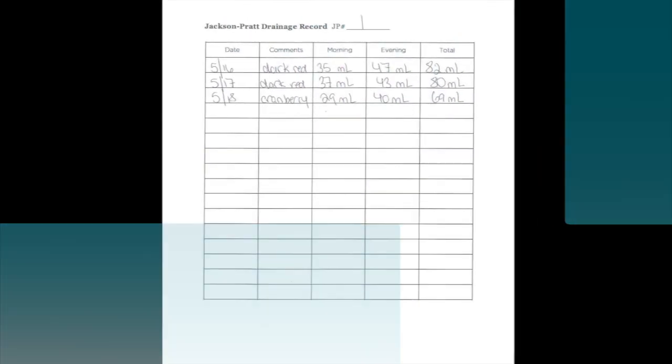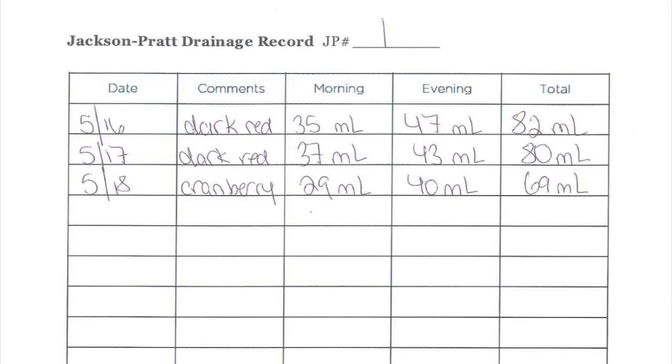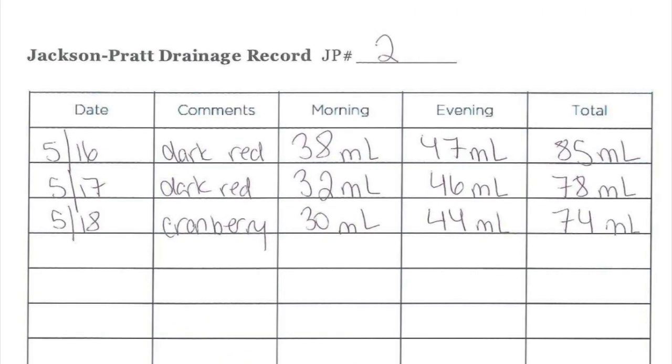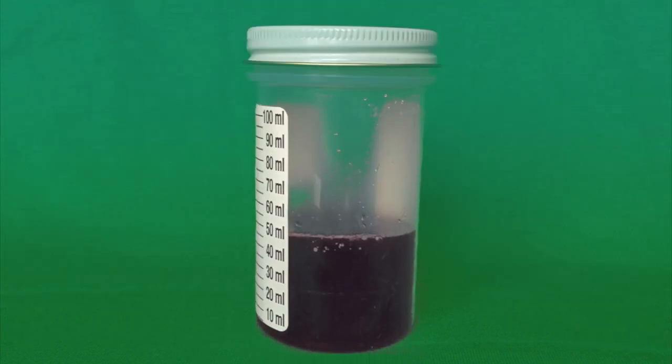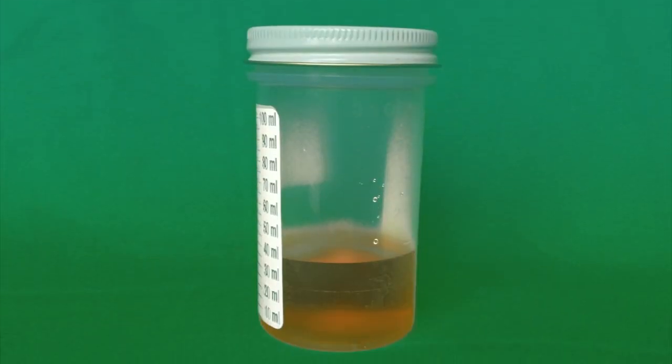Note the measurements on the container are in milliliters, MLs for short. If you have more than one drain, measure and write down each one separately. Remember, the color and consistency of the drainage will vary. It might be dark red, the color of cranberry juice, or a yellowish straw color. If the drainage is bright red, you should call your surgeon's office right away.